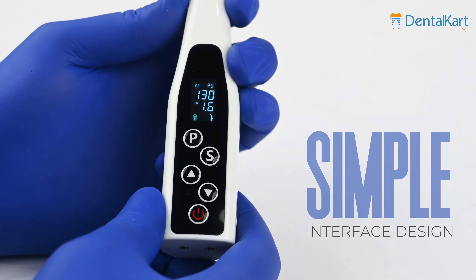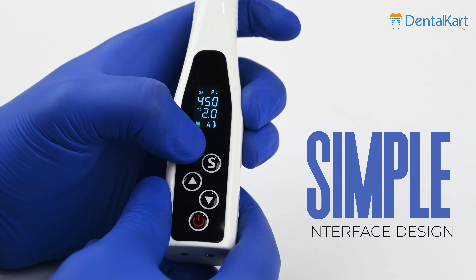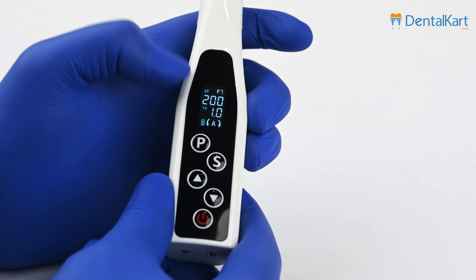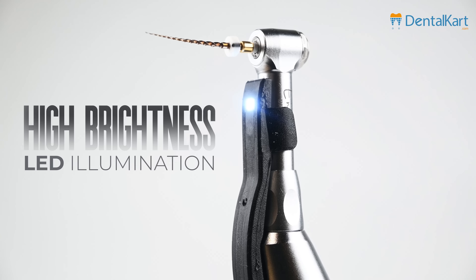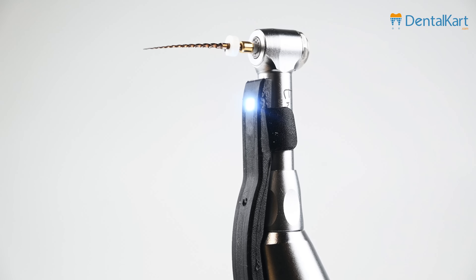Featuring a user-friendly interface, the Endoking Cordless LED Endomotor simplifies operation, enabling clinicians to navigate settings effortlessly and focus on delivering optimal patient care. Equipped with a high-brightness LED, this endomotor provides superior illumination during root canal treatments.